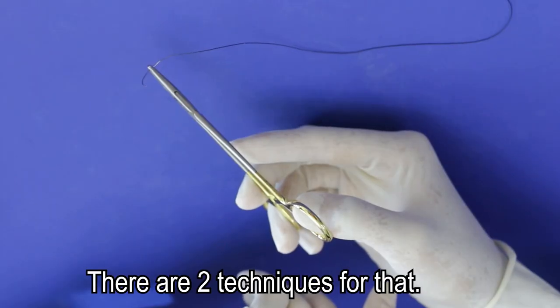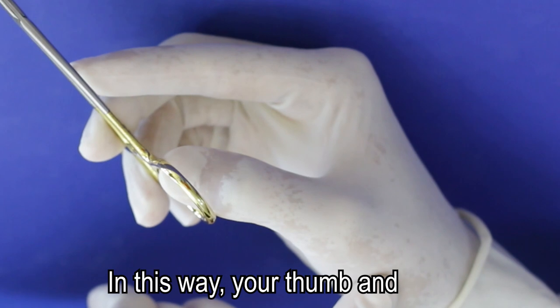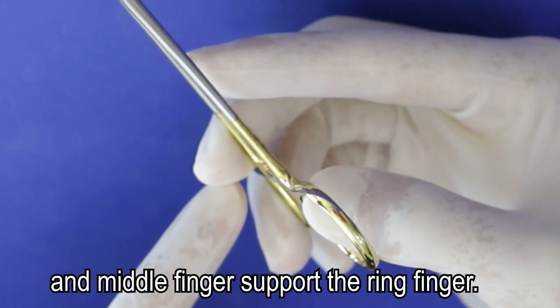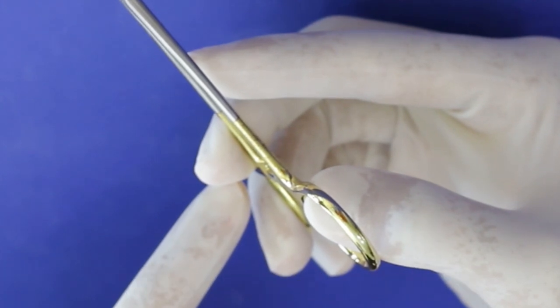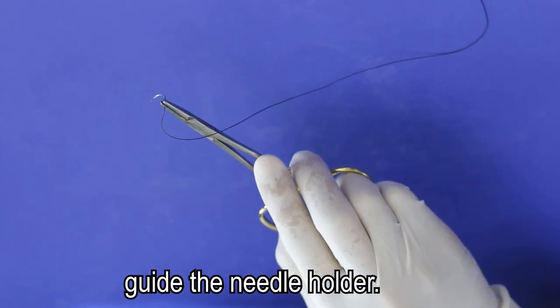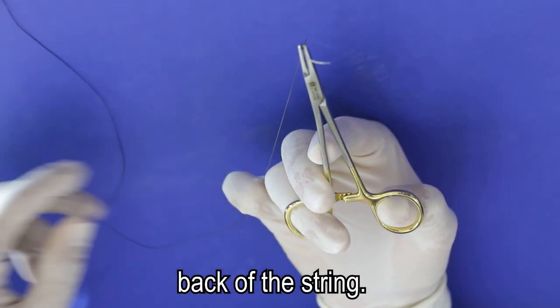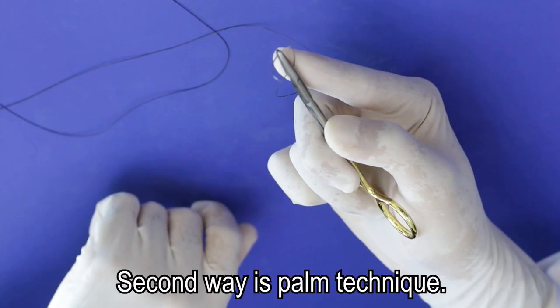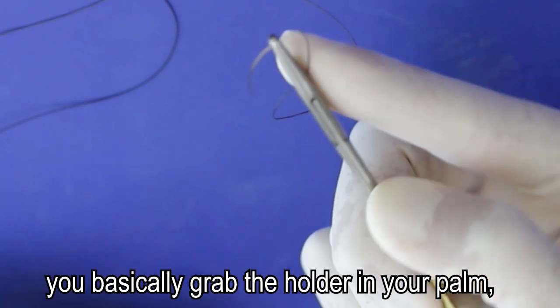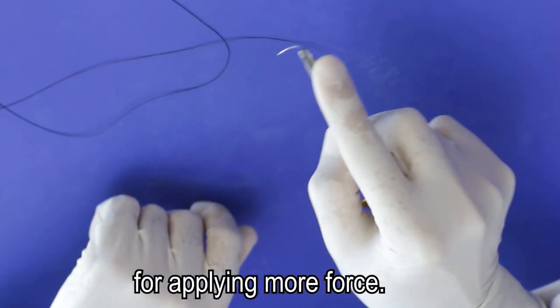There are two techniques for that. First one is the five finger technique. In this way, your thumb and ring finger hold the handle, the middle finger supports the ring, and the index finger guides the needle holder. Lastly, the little finger takes the back of the string. Second way is the palm technique. In this style, you basically grab the holder in your palm, and this is going to help you apply more force.